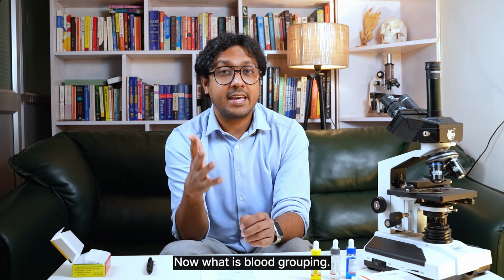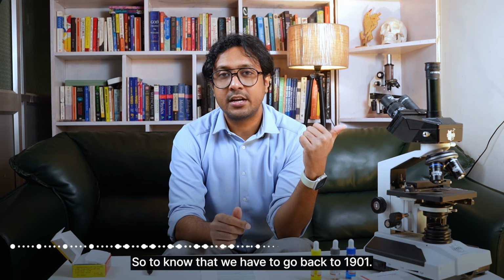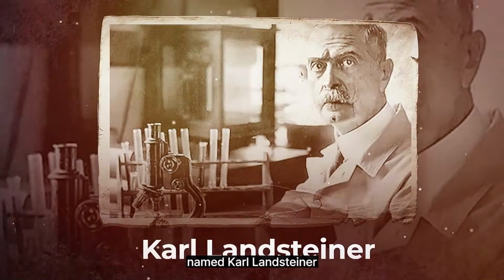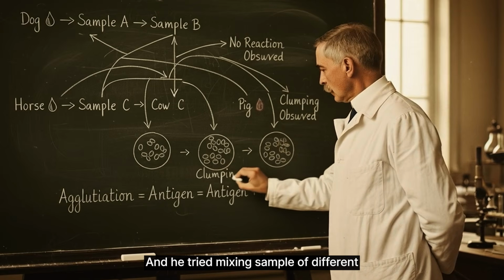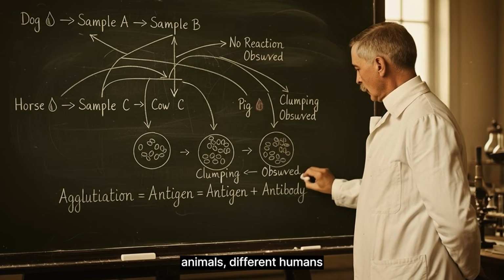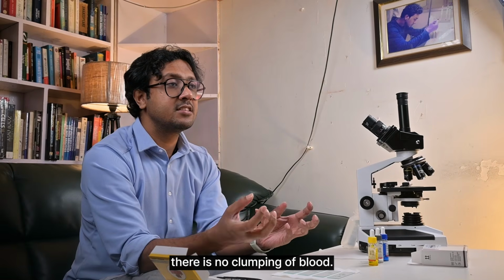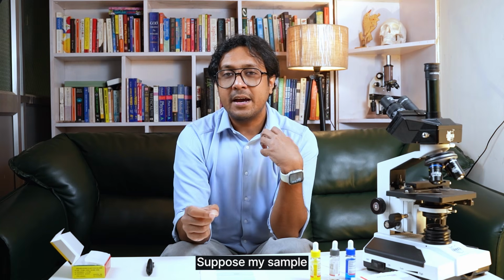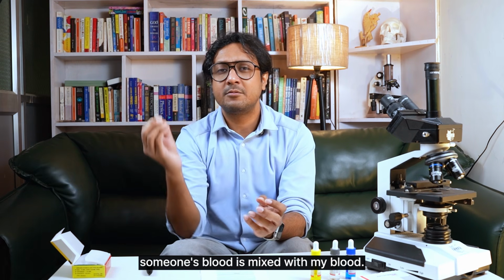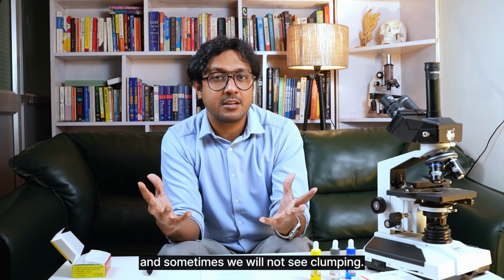Now what is blood grouping? To know that we have to go back to 1901, when an Austrian scientist named Karl Landsteiner, a physician, tried mixing samples of different animals or different humans. He found that when a few samples are mixed there is no clumping of blood, but when some samples, suppose my blood with another person's blood, are mixed, sometimes we'll see clumping and sometimes we'll not see clumping.